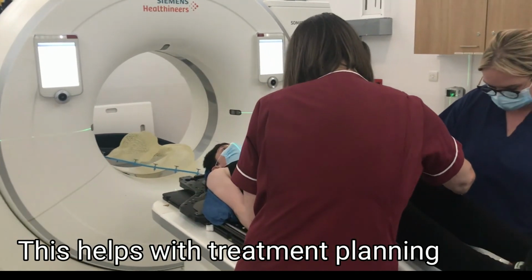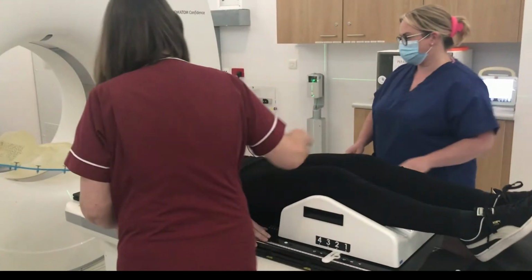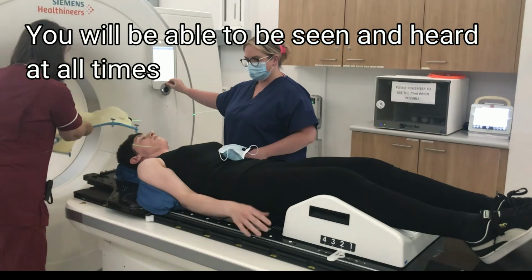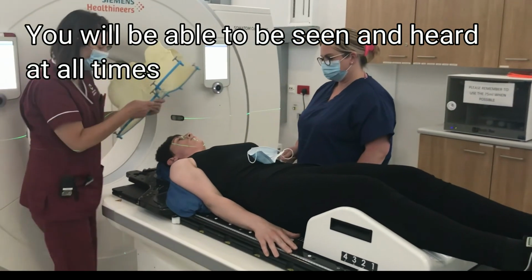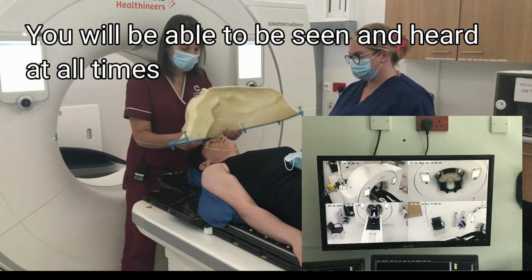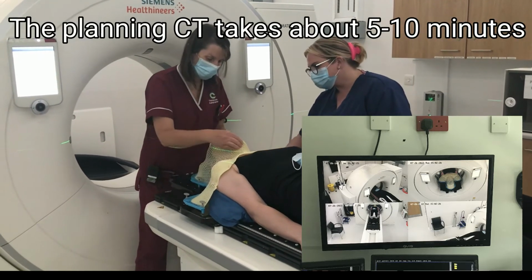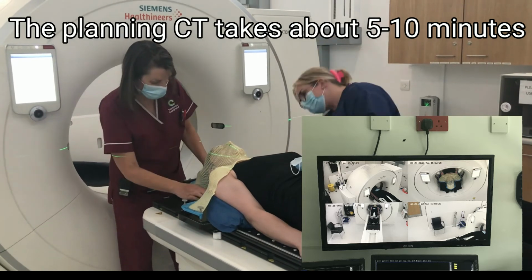The radiographer will position you into your mask and set up the scanner. Once they are ready, they will leave the room to operate the scanner from the adjoining control room. They can see, hear and communicate with you at all times. The planning CT takes between 5 and 10 minutes depending on what is required.